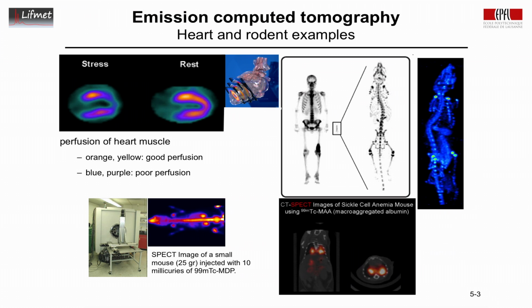And here is an image of a bone scan. This is the same technique that we have here. This is rotating. We can see again the glands here taking up a lot of the tracer, and otherwise it's a good tracer of the skeleton of this animal.